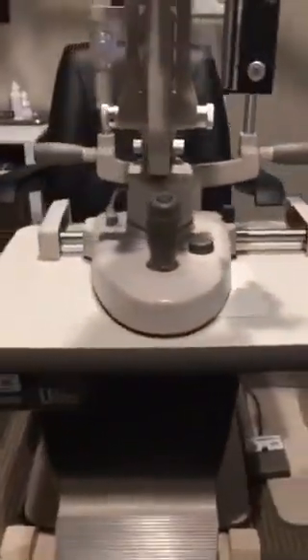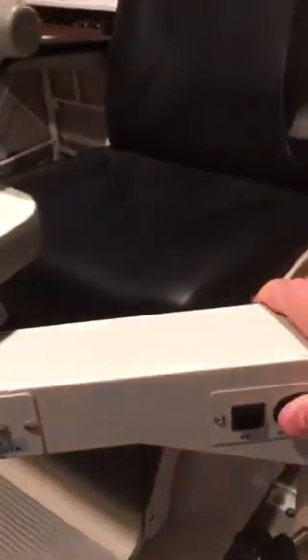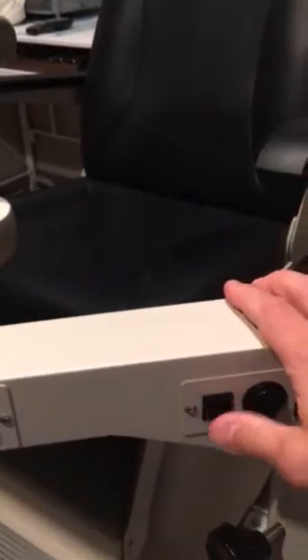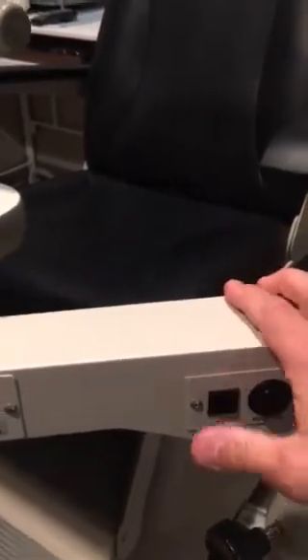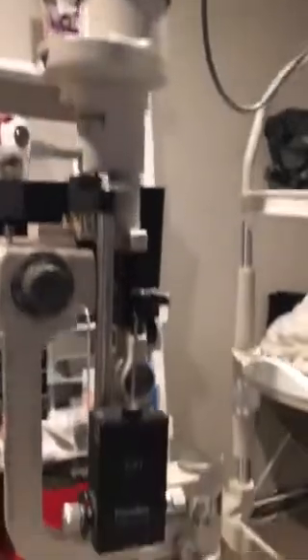So with the slit lamp, it's going to be mounted to a table of some sort that can raise up and down. The patient will be sitting behind the lamp. Sometimes we'll have controls here that'll raise our chair up and down, or of course move the slit lamp up and down. We can also turn the power to the slit lamp on and off here.